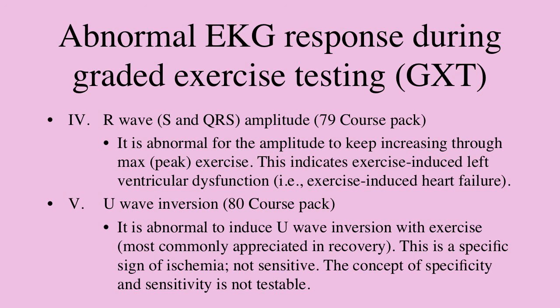That's an abnormal sign. So that concludes the normal and abnormal EKG response during GXT. And again, for a clinical exercise physiologist, that's an important area in this course.